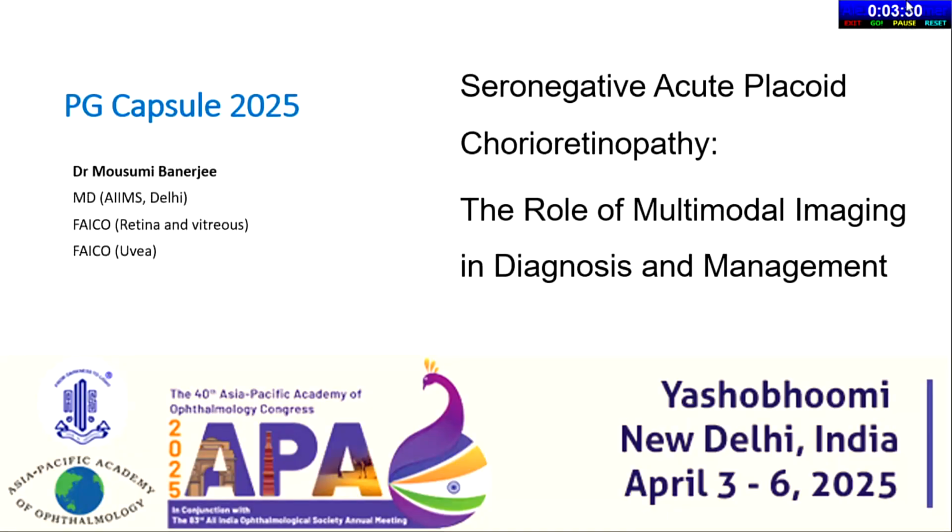I'll be presenting a case of seronegative acute placoid chorioretinopathy. Basically, I'll discuss the role of multimodal imaging in diagnosis and management of this case.